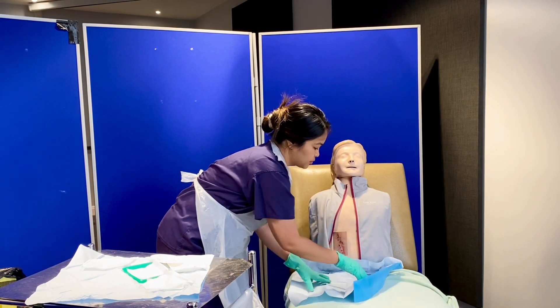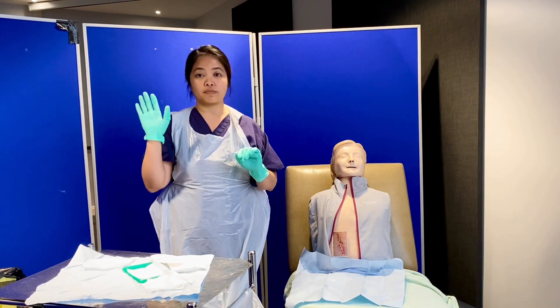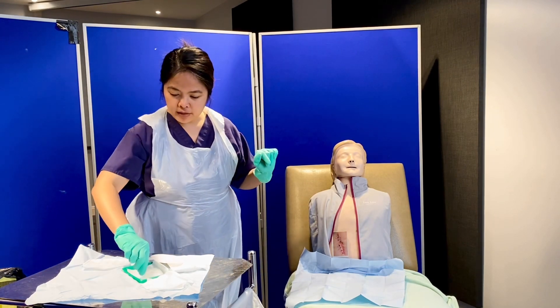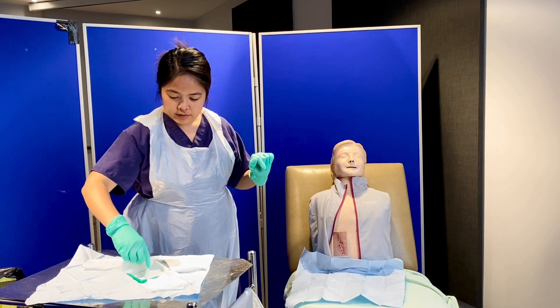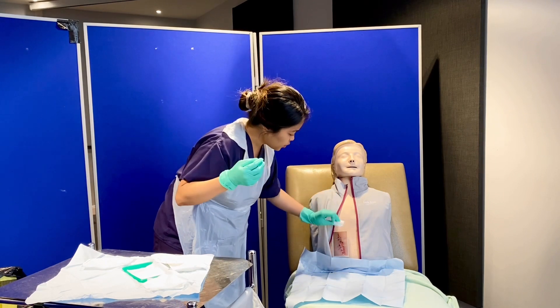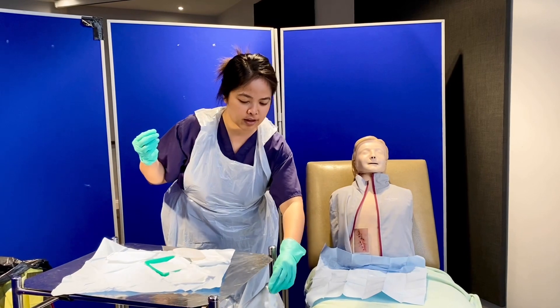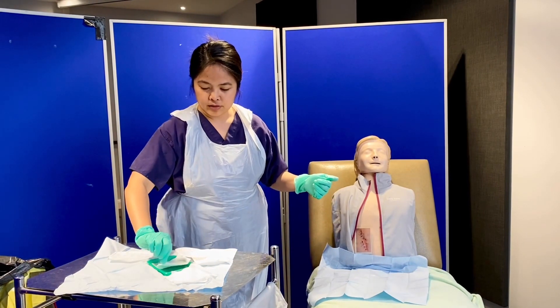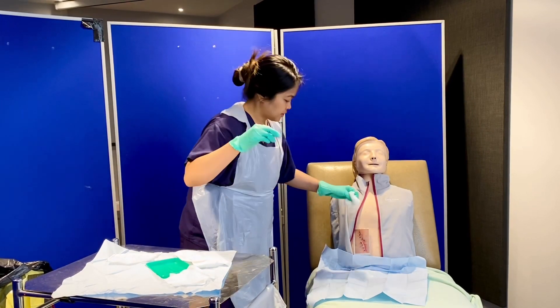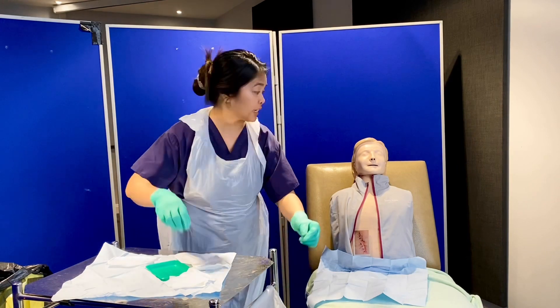I'm happy to proceed now. I declare that my right hand is my clean hand and my left hand is my dirty hand. Jane, I'll be cleaning your wound from cleanest to dirtiest using a single stroke. Is that painful or is there any tenderness in the area? No, that's okay. I'll just make sure that I don't over-wet the wound.